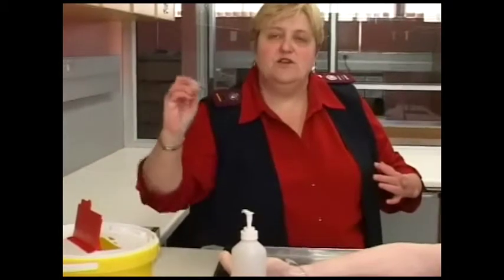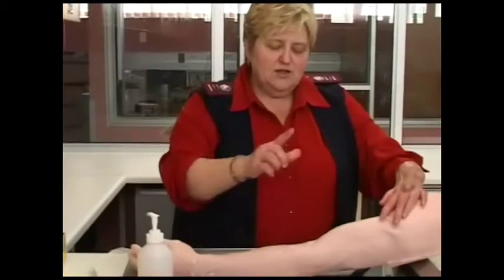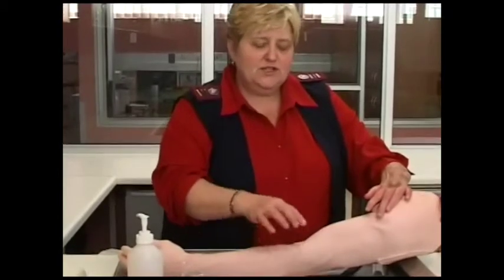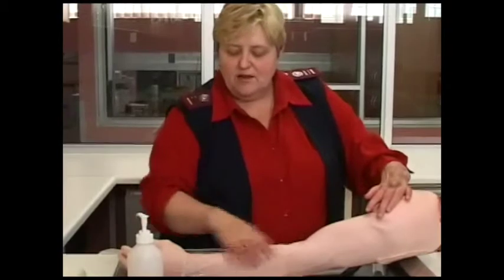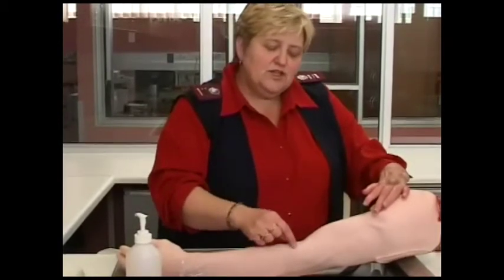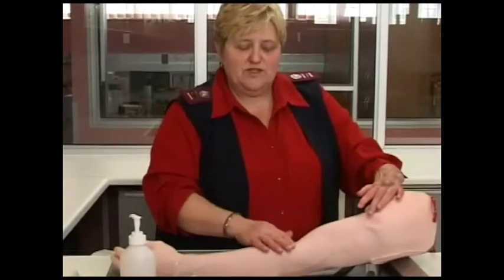You can throw your syringe in as well. After drawing blood, always make sure that the patient is not bleeding anymore. Before they leave, make sure there is no blood going down the arm. Also check for bruising — if there is bruising, tell the patient to apply ice or a hot pack to their arm.